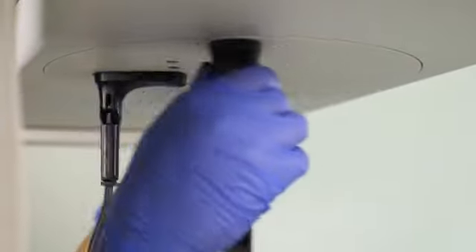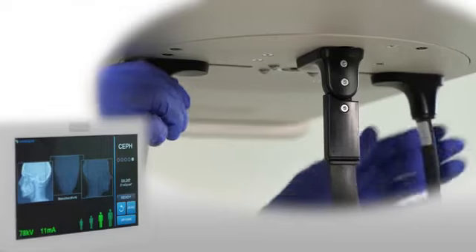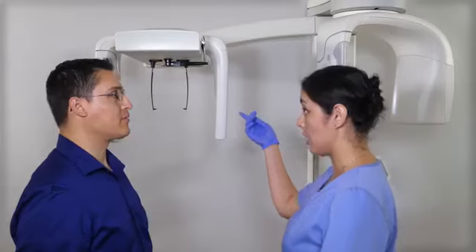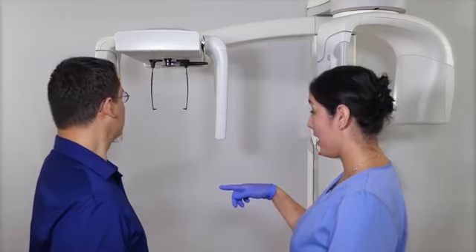Rotate the cephalostat to the proper position based on the desired function or study type. Rotating the cephalostat will automatically configure the system for the chosen cephalometric study type. Now that the Ceph function is chosen, explain the examination to the patient.